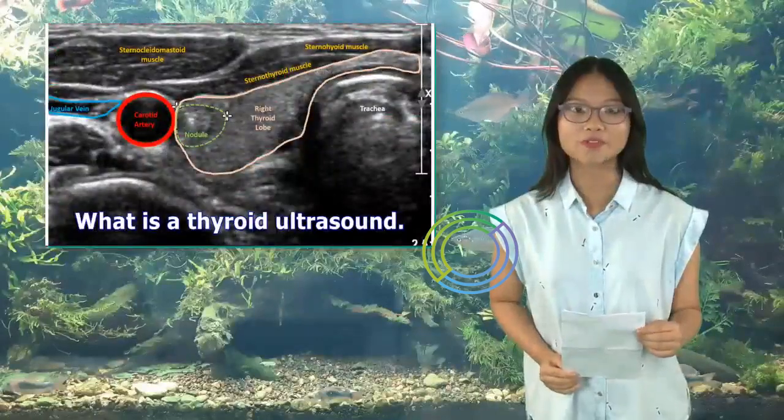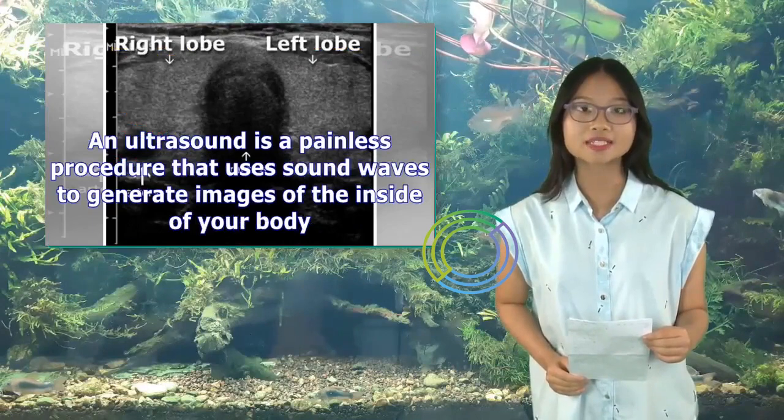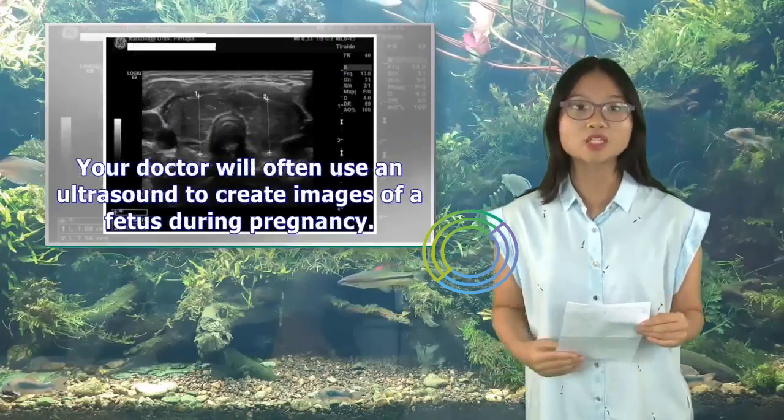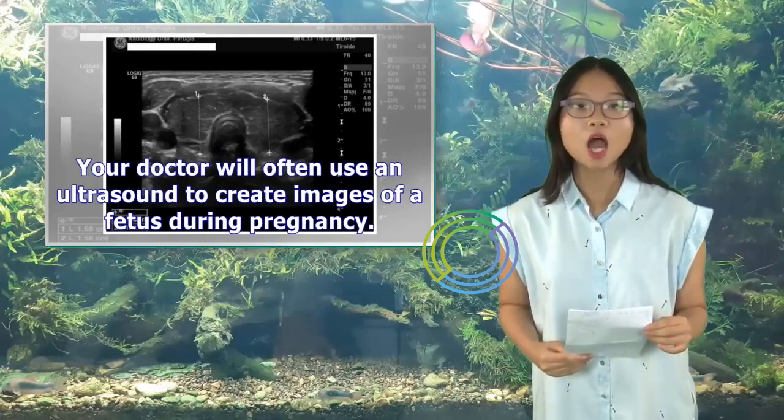What is a thyroid ultrasound? An ultrasound is a painless procedure that uses sound waves to generate images of the inside of your body. Your doctor will often use an ultrasound to create images of a fetus during pregnancy.